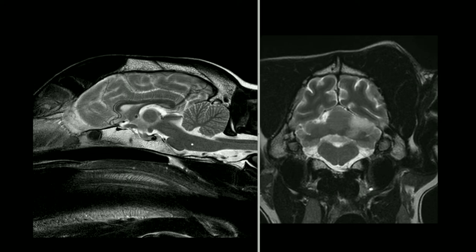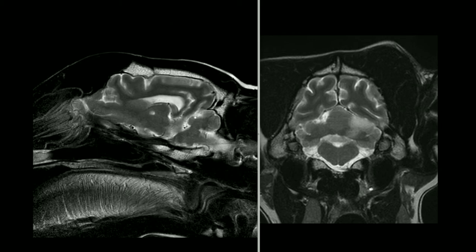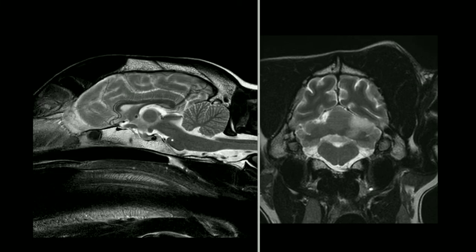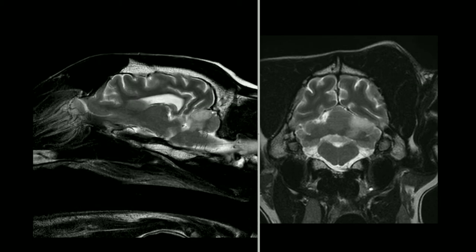On the sagittal plane images, we can see the small lesion in the right cerebellar hemisphere rostrally, the small angular-shaped lesion in the right thalamus, and scrolling to the left, a very nice almost wedge-shaped lesion in the left rostral cerebellum predominantly in the grey matter but also extending into the cerebellar peduncle. Interestingly, in this case there is also a small extension of the lesion into the left caudal colliculus.